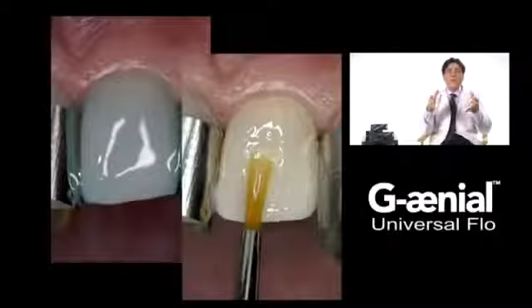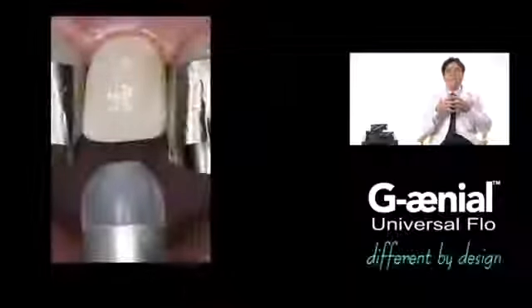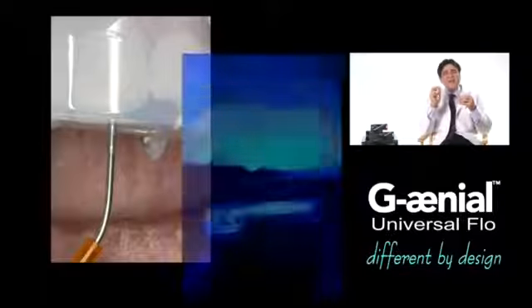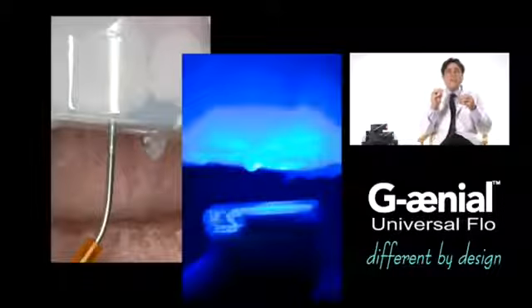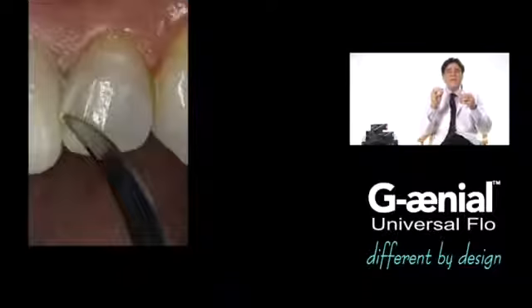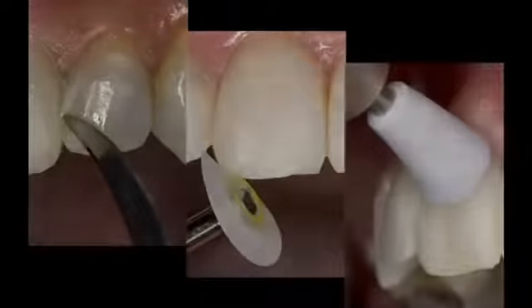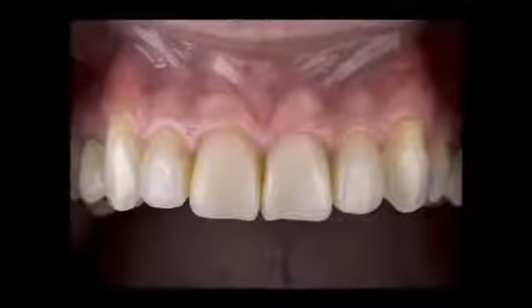This process can be performed intraorally without anesthesia and can provide valuable information for proper lip position and phonetic considerations. A clear vinyl polysiloxane impression can be used to replicate the diagnostic wax-up. The matrix can be placed intraorally and used as a transfer vehicle for the flowable composite to be injected.